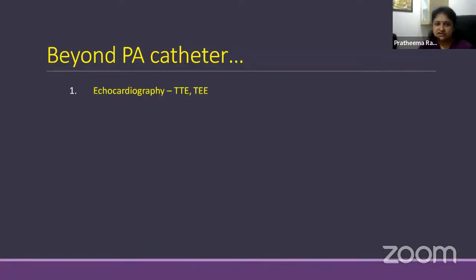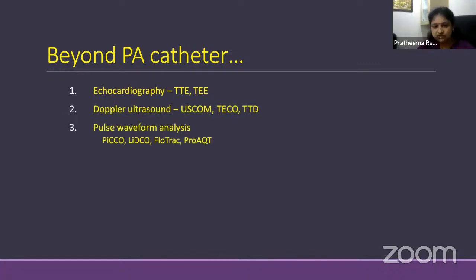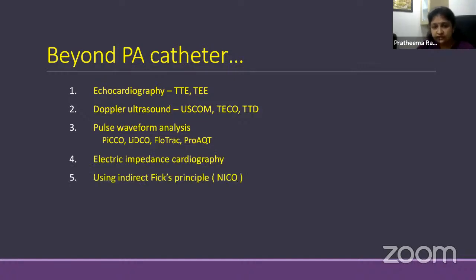So echocardiography, this is going to be there for many years together, either transthoracic or transesophageal. There is also a Doppler ultrasound, which we'll be talking about. Then pulse wave form analysis, PiCCO, LiDCO are minimally invasive. FloTrac is also the same, it needs an arterial line in situ. And we also have electrical impedance cardiography. And we have others, NICO, which uses the indirect Fick principle, and bioreactance and NexFin.